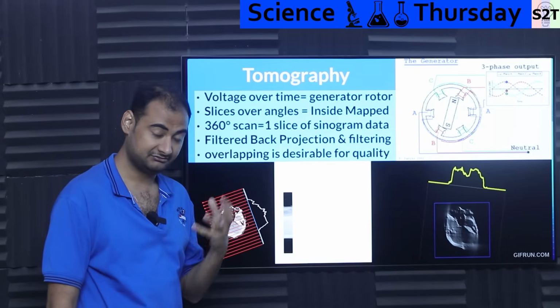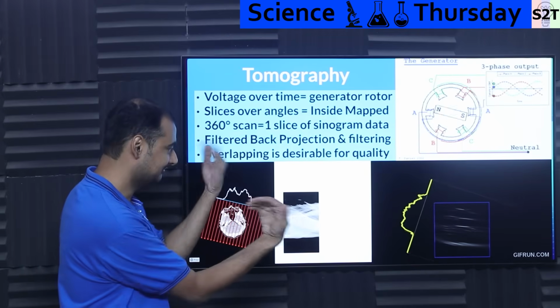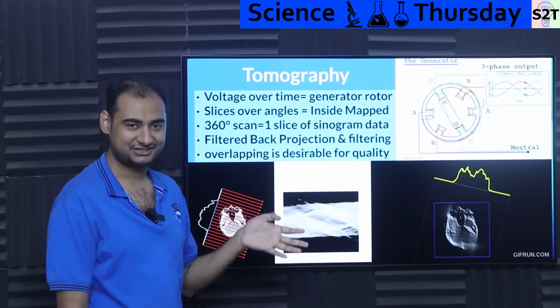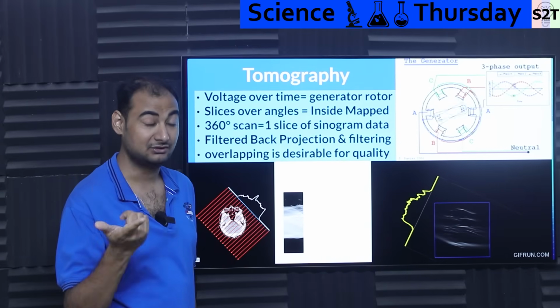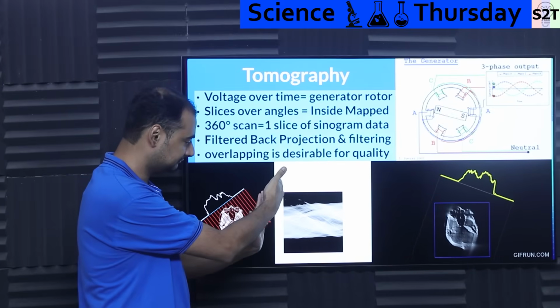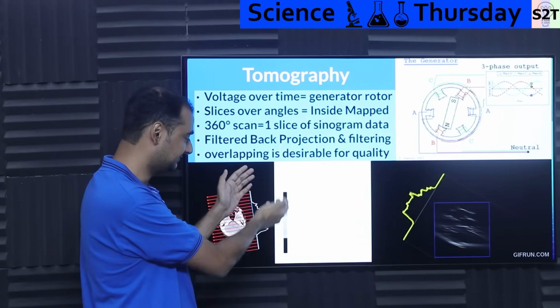But very smart people, and if you ever wondered what people do with mathematics, mathematics is like, oh, I can see a skull here. It's like, what the hell? Fourier transform and filtered back projection. Ta-da! You back project it. Basically, if you know the rotation, where the sensor was, the best way to describe this slice would be luminosity, basically how bright this puppy was.